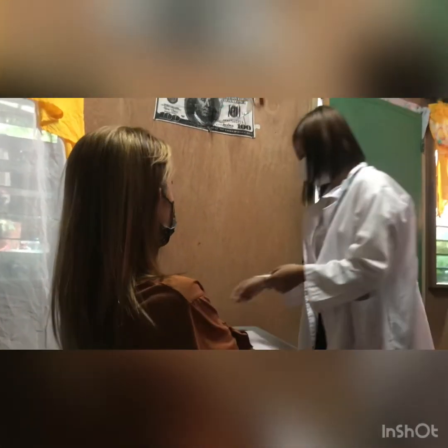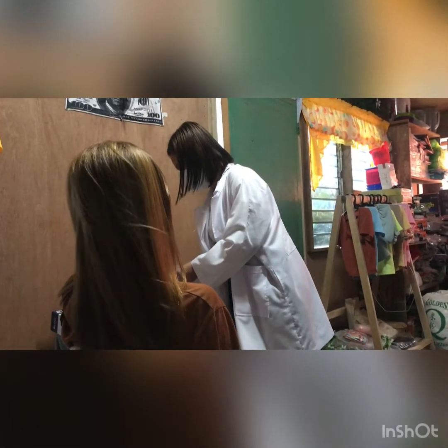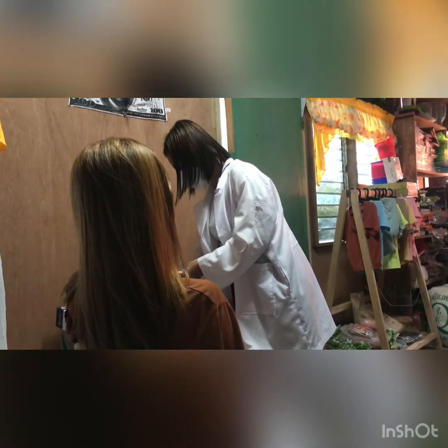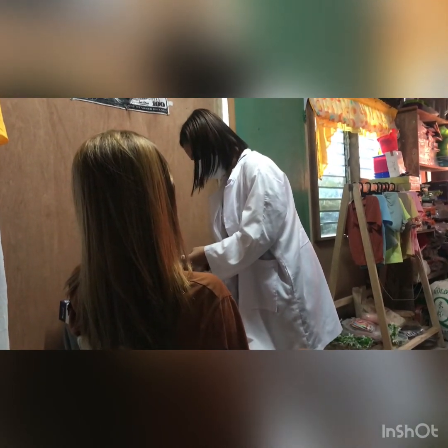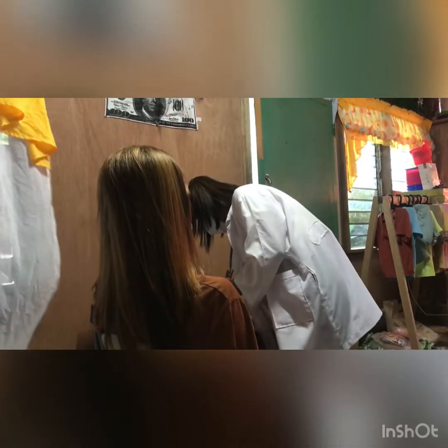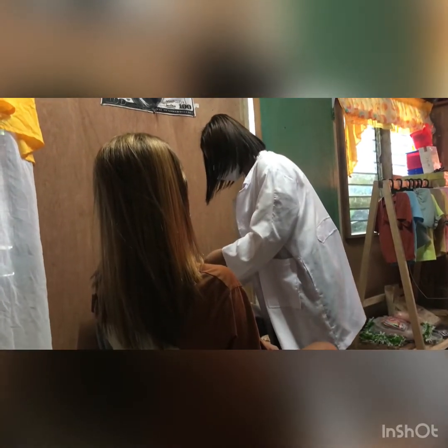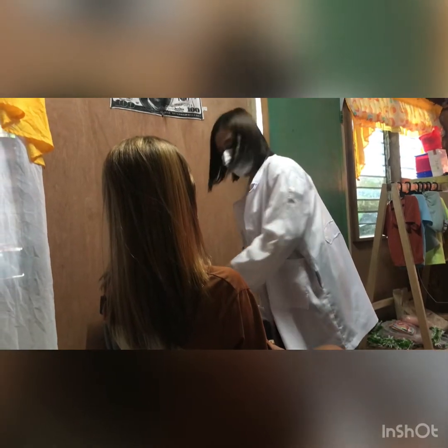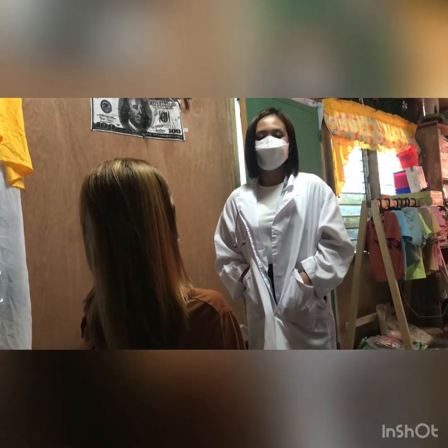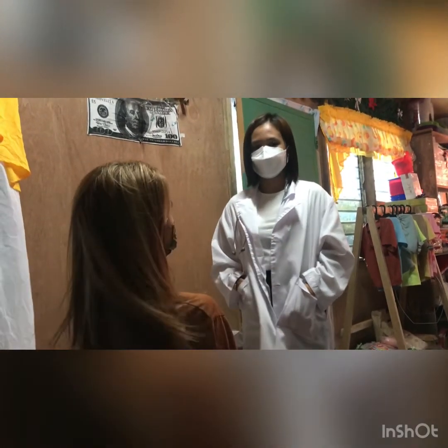Ma'am? After that, use the cotton, then note the temperature of the client. Ma'am, your temperature is 36.0 degrees Celsius. Note, remain holding the thermometer in place if the client is irrational or is very young. Thank you.